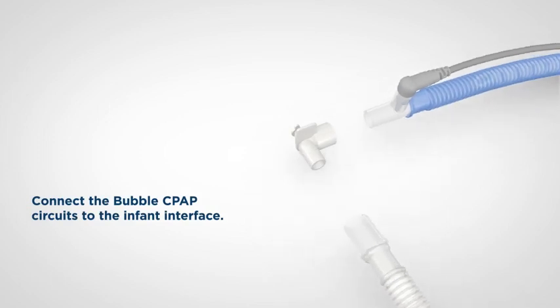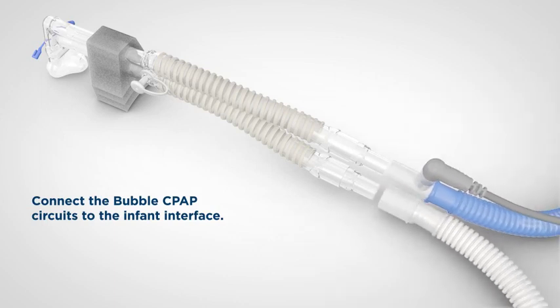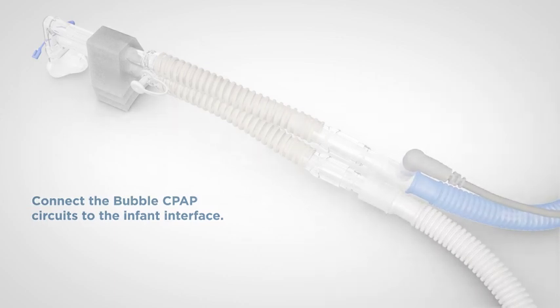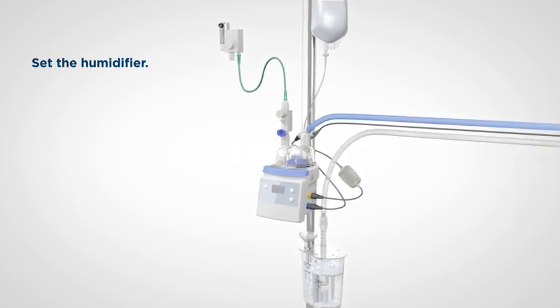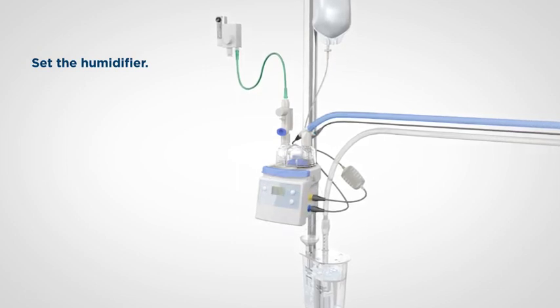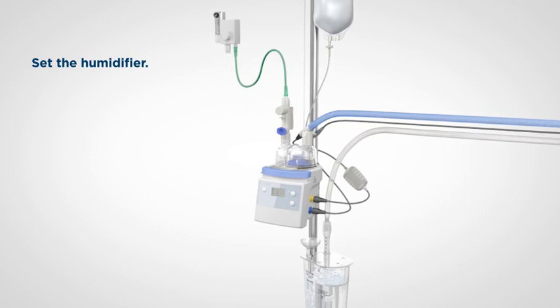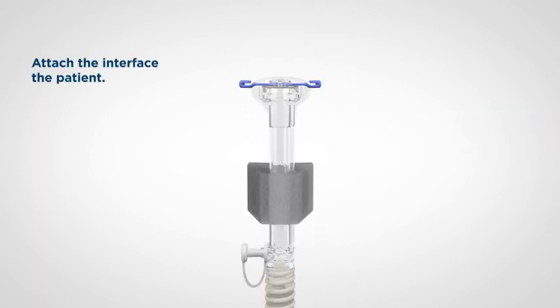Remove the flow test elbow and connect the circuits to the infant interface using the instructions provided with the interface. Ensure there is air flow present before turning on the humidifier. Turn on the humidifier. If using the MR850, ensure it is on invasive mode at 37 degrees Celsius. Now you're ready to connect the interface to the infant using the instructions provided with the interface. Ensure that the system is running before connecting to the infant.